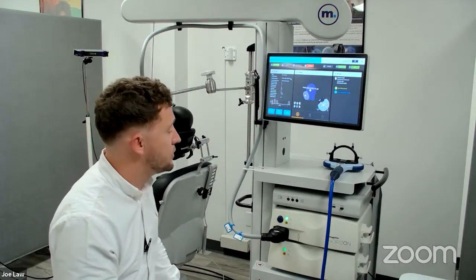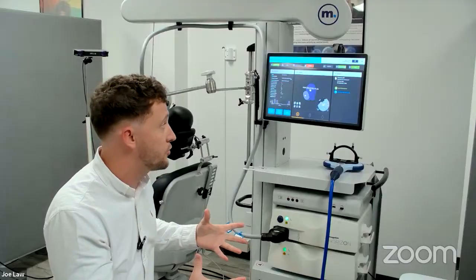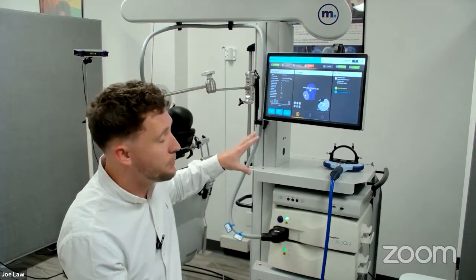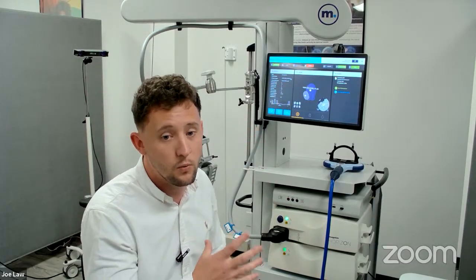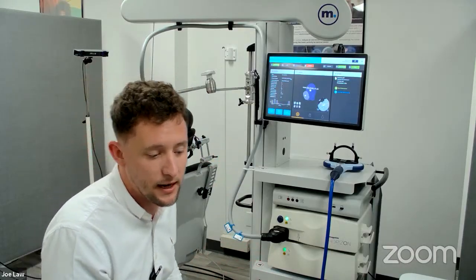Once you've then delivered those missed pulses, or if you had a 100% score, that would obviously be the end of the treatment. The patient is free to leave until they come back in tomorrow to go over the treatment portion. The mapping portion and building a treatment plan is only generally done once, twice per patient. The run treatment would be done 36 times. That would be the full workflow.